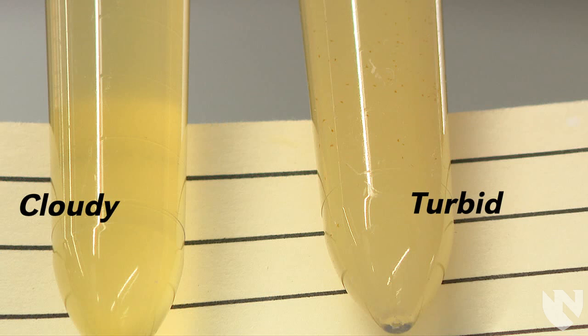Lastly, we have a cloudy urine versus a turbid urine. Notice in the turbid urine, we cannot see the lines at all and we have very large dense particles.